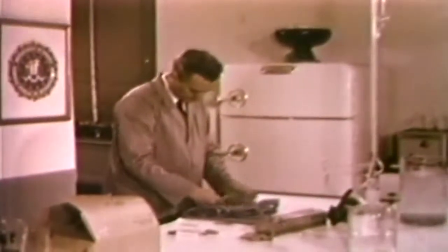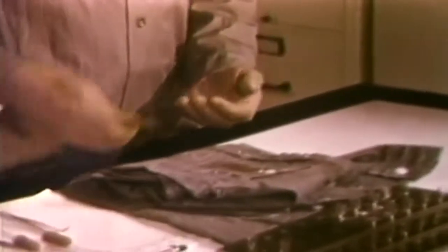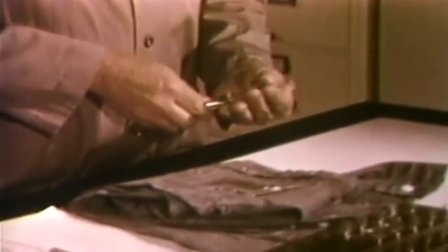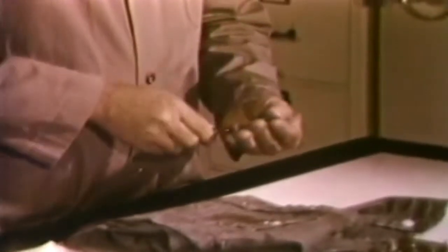Next, origin and blood group must be determined. These tests will determine whether blood is of animal or human origin, and if human, of which blood group. Small pieces of the stained cloth are placed into test tubes. Cuttings from the unstained cloth are similarly taken, placed in test tubes, marked, and serve as controls.